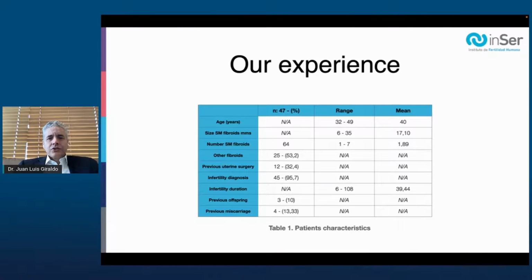Thank you. So that was the video we published in Fertility and Sterility and the case report that shows the technique that we developed, the double lumen cannula that we developed as well, to be able to extract these complete fibroids in patients basically with infertility and with very good advantages in their possibility of conserving their healthy myometrial tissue and of restarting their fertility treatment really soon after this surgery. So we want to share with you our experience with our surgery and our developed technique.